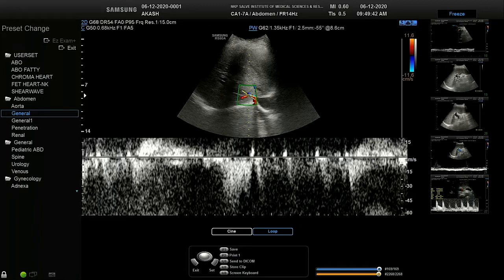So, okay. So this patient is a young patient, has yellowish discoloration of eyes, swelling over both lower limbs, and abdominal distension. Any history of hematemesis? He is a chronic alcoholic. So being a chronic alcoholic, we expect a hepatic cause here. As you can see, the obvious there is distension.